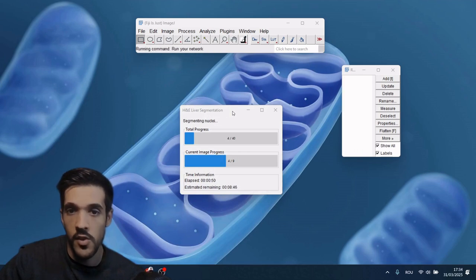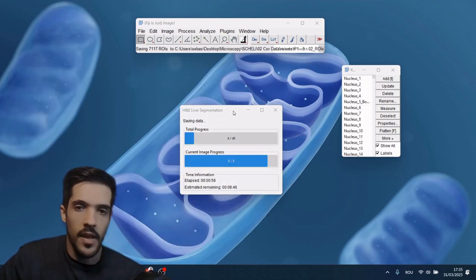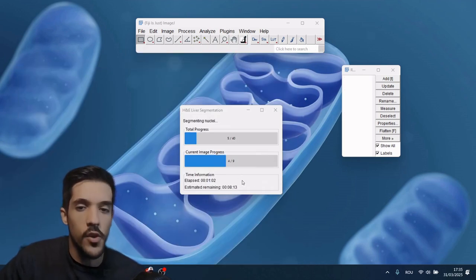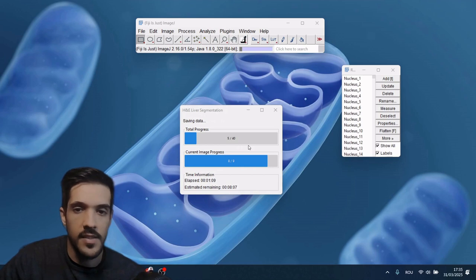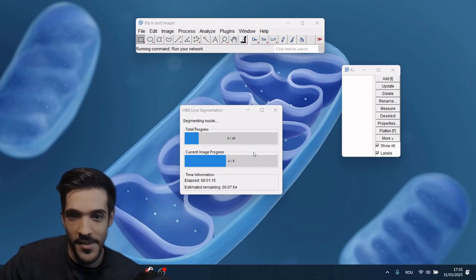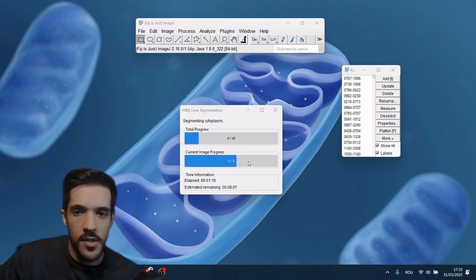So if you want to compress using JPGs or PNGs, it will not affect the total time it will take for the result. So here you can see in real time, it does not take that long. It might differ from device to device, but it usually does not take more than half an hour for whatever analysis you have to do. And that's pretty much it.